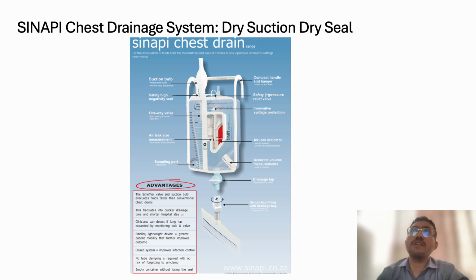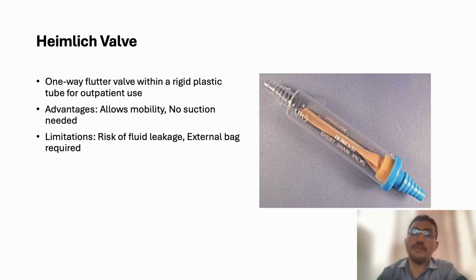Also, the negative suction is applied from here, and there is a regulator which controls the volume of negative suction that can be applied to the patient.